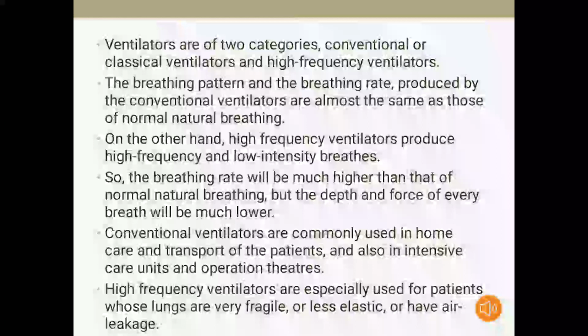But on the other side, considering high frequency ventilators, they produce high frequency and low intensity breaths, which means the depth and force of every breath would be lower, and the breathing rate produced by them will be higher than normal natural breathing. They are especially used for the patients whose lungs are very fragile or less elastic, or those who have an air leakage.